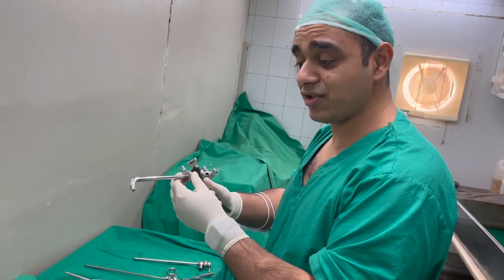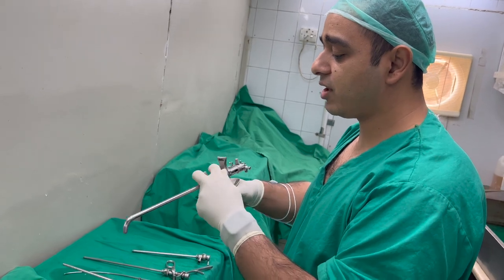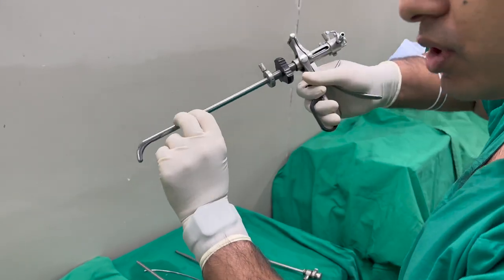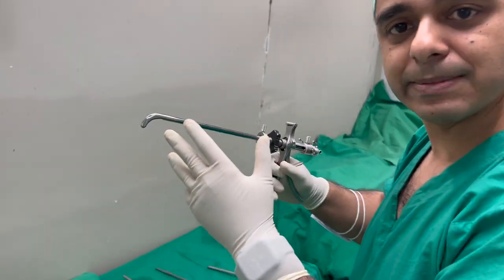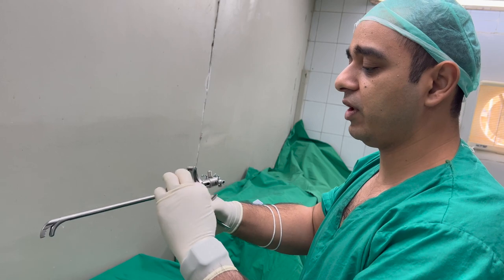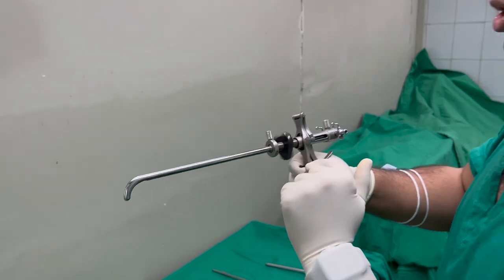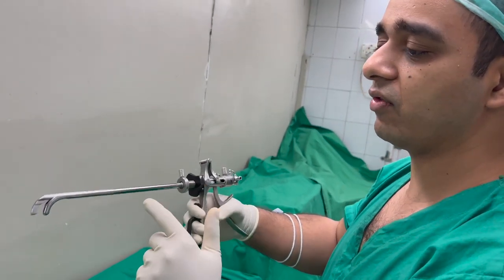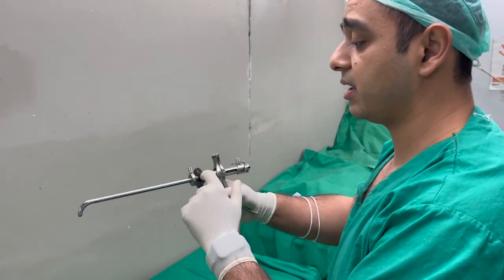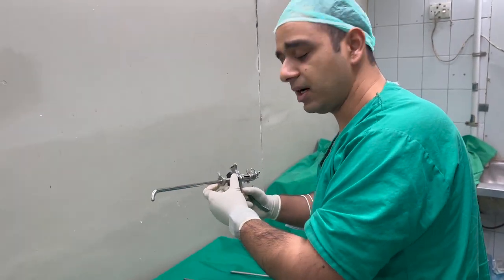This is a very unique and very dangerous instrument — this is a lithotrite. It is a very dangerous instrument because it goes blindly into the urethra, like we place Clutton's metal sound dilators into the bladder. We open and loosen it — how much we want — and then fragment the stones and take them out. Bladder perforation can occur through this. For bladder stones we use it, but now most people don't use it anymore — we are going towards laser, punch, and other modalities.